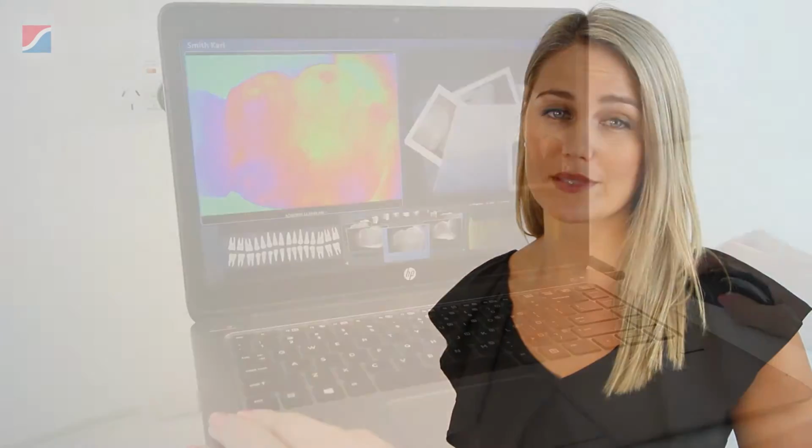For interproximal decay, if it hasn't breached the dentine yet, you can easily monitor with the DIAGNOcam and review when the patient comes in for their next visit.